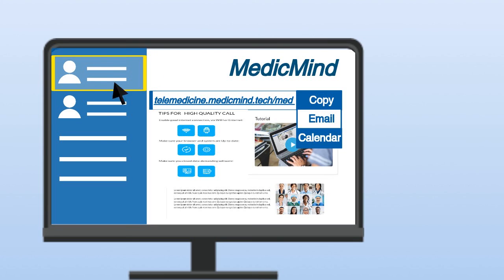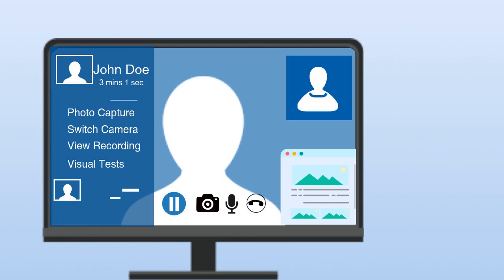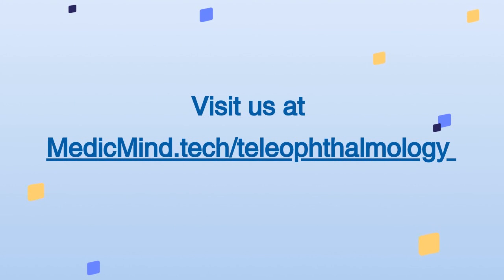Patients will be queued accordingly as they come online. To begin a call, simply click on the name on the left-hand menu and you are set to go. MedicMind — empower your clinical care now.